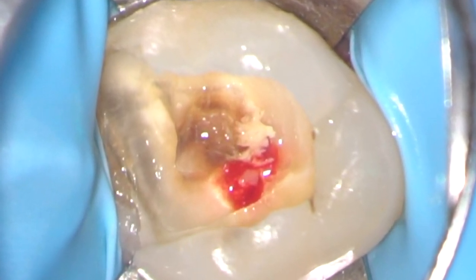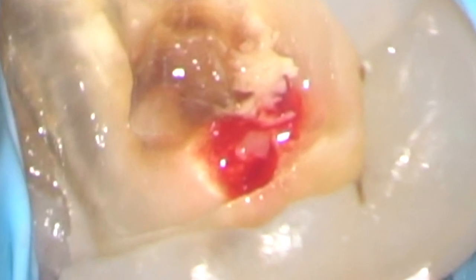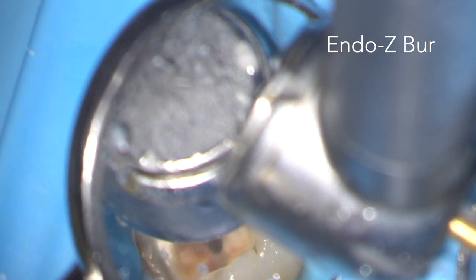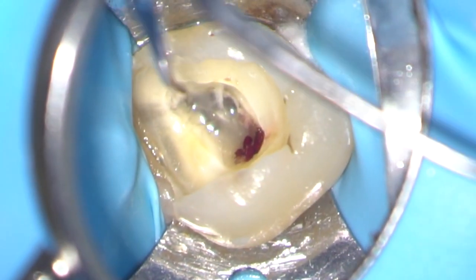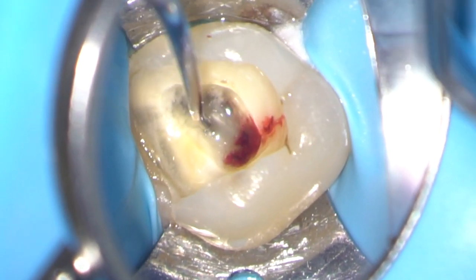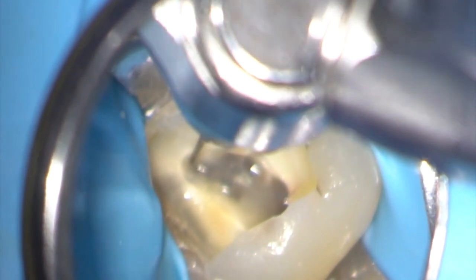I've perforated the roof of the pulp chamber in the region of the palatal canal and I can now sink a non-end-cutting tungsten carbide endo burr through this perforation and lift off the roof of the pulp chamber. Here I'm using an endodontic probe to remove calcification from the orifices of the root canals.